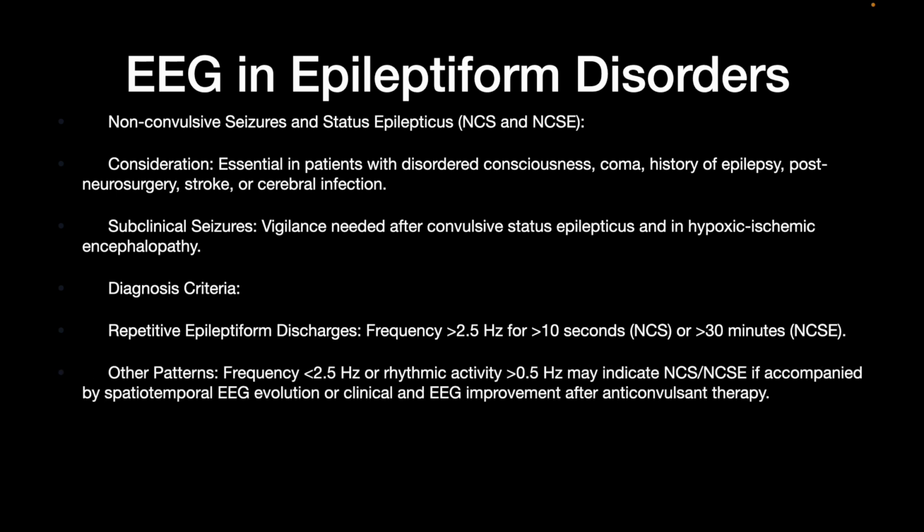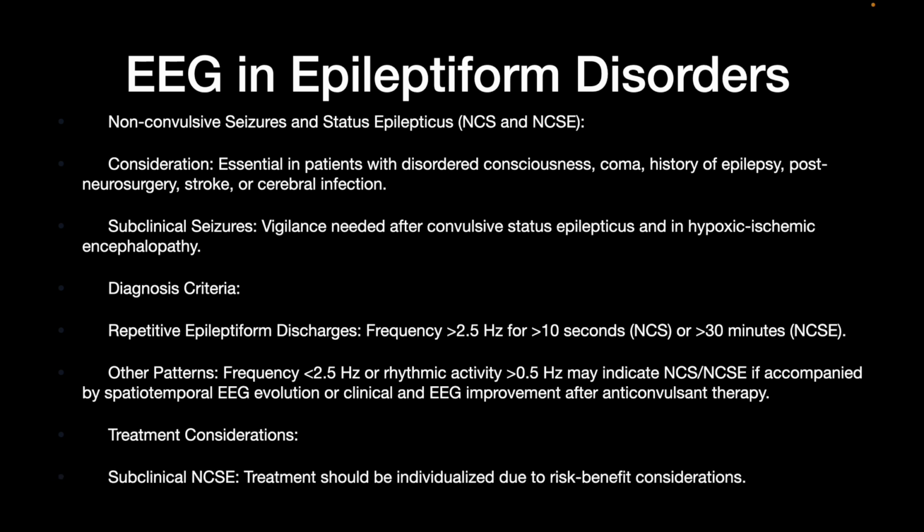Now, other patterns with frequency less than 2.5 Hz with rhythm of more than 0.5 Hz may indicate either non-convulsive seizure or non-convulsive status if accompanied by spatiotemporal EEG evolution or clinical and EEG improvement after anticonvulsant therapy. The treatment is individualized due to the risk-benefit to be considered.